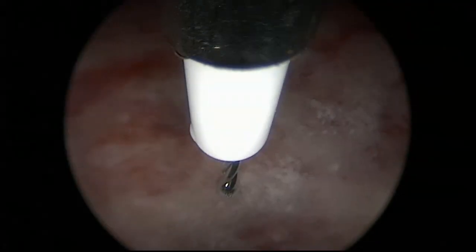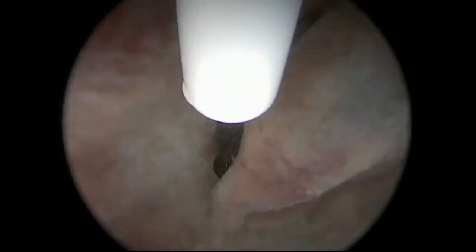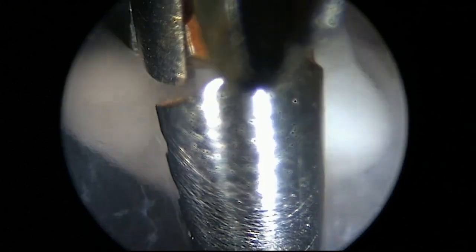Using the 5 French Twizzle bipolar device, the gestational sac is opened and the diagnostic hysteroscope is advanced inside the gestational sac. The embryo is clearly visualized. Using the hysteroscopic grasper, the embryo is grabbed and easily removed, avoiding contamination with maternal tissue. Also, chorionic villi are removed under direct visualization, avoiding contamination by the surrounding tissue.